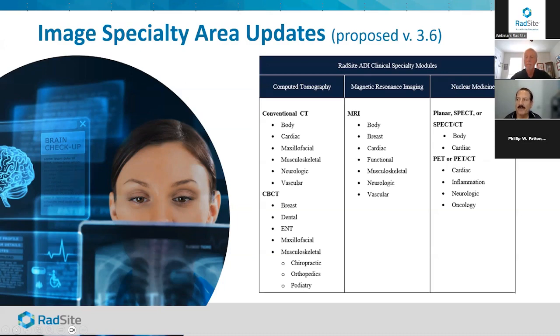What is the optimal field strength? Do you need a 3 Tesla or 1.5 to do advanced prostate imaging? What should be the requirements for the number of slices or number of sections for cardiac imaging with CT? What's the minimum number that should be required for even doing a CT pulmonary angiogram? What is optimal? And what we found is that a lot of debate exists about these, and so this really makes the physics portion of it so important.